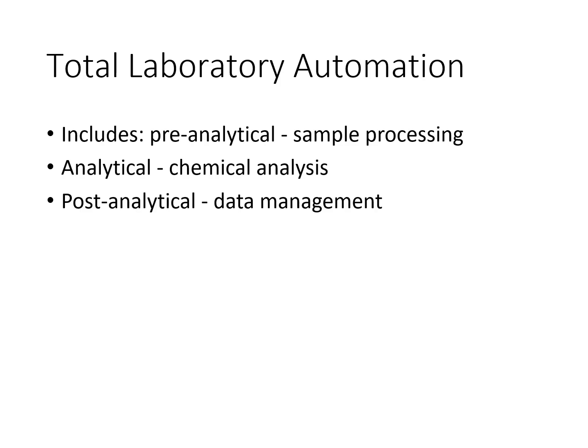Some benefits of total lab automation are that it minimizes manual labor and reduces human error. It can increase throughput and reduce turnaround time for results. It can enhance accuracy and precision by standardizing processes, and it can also facilitate better workflow and sample tracking.